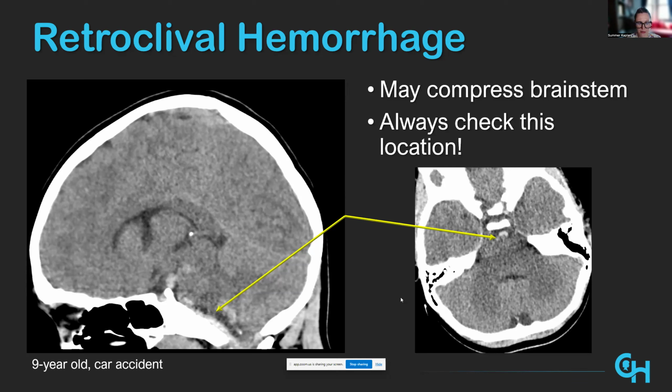It does happen sometimes also that patients are susceptible. They may have an underlying collagen vascular disorder or something where their vessels may be prone to injury. So I wouldn't not look there in lower severity mechanisms. But generally, it's going to be a higher severity mechanism that would make you want to focus your attention there.